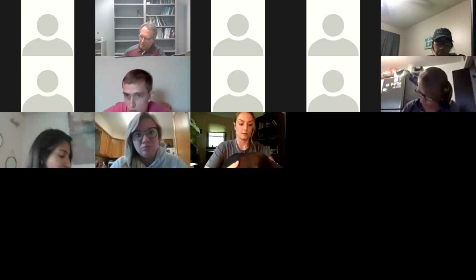Okay, please put your Zoom screens on speaker view so that I am big because I've got something important to show you. Okay, so I've put my hand and arm in this socket liner that has this pin. And so like the fellow that you were just looking at, they would make sure it was clean and adherent inside of it. They may put socks on the outside depending upon if they need something to augment the fit of this. But then there's this pin in here, and then there is a hole on the bottom of the socket.